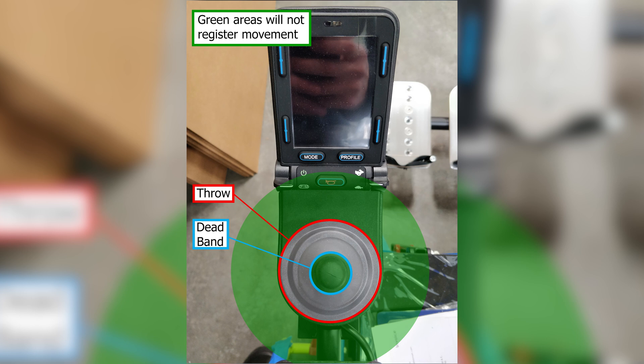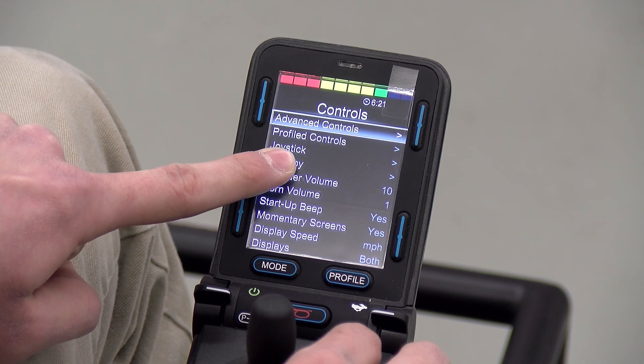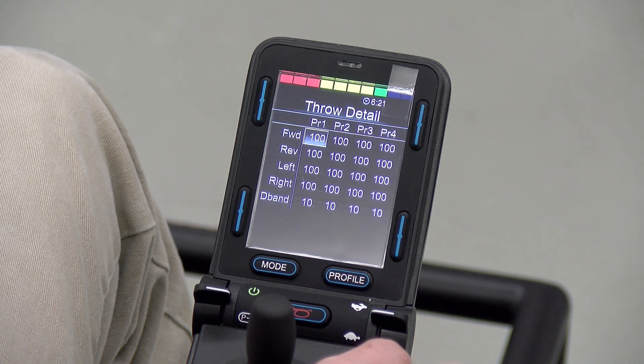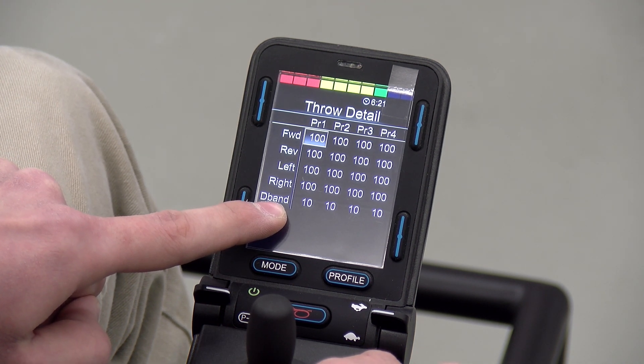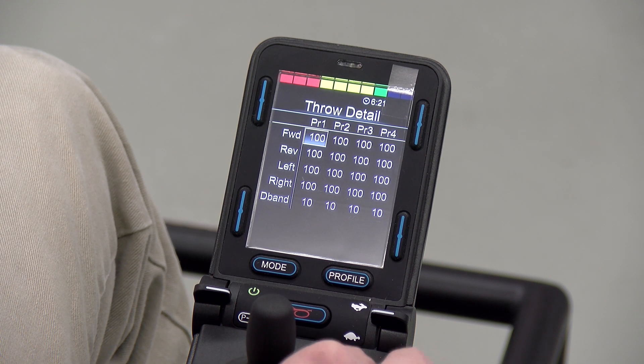One thing deadband can help with is jerkiness. If your chair is jerking around while you're stationary, you can try turning up the deadband so that the joystick will not register those very centric movements — you'll have to move it further out to register movement, because you're expanding that dead zone in the middle. To access these settings, go to controls, joystick throw, detail. The throw has separate forward, reverse, left, and right settings so you can adjust all of those individually, whereas the deadband is one singular setting. These settings aren't really necessary for most players but they are there in case you need to use them.